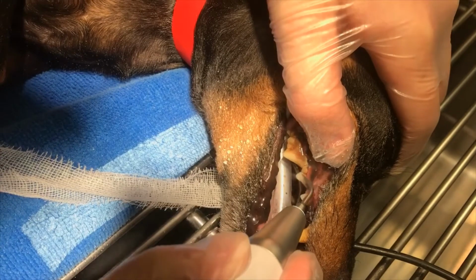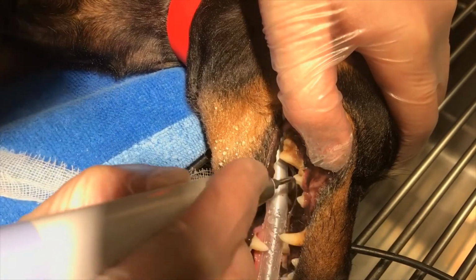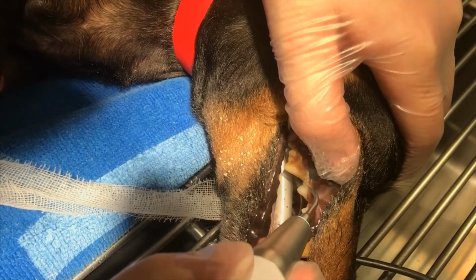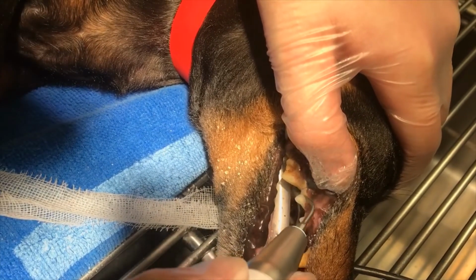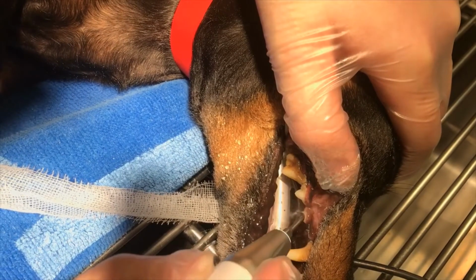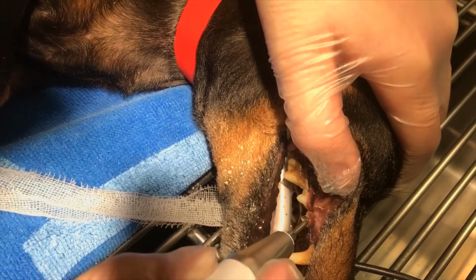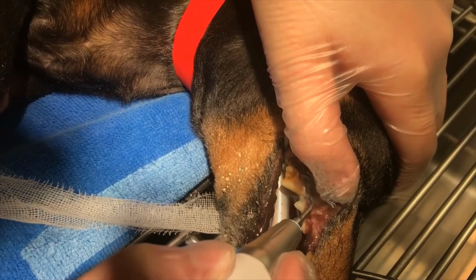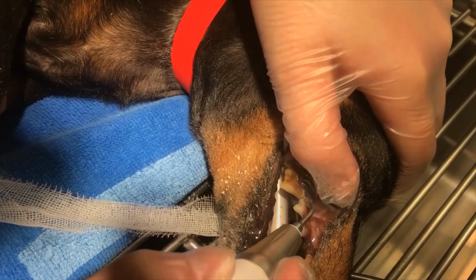It's better and easier to use the wider part of the ultrasonic scaler, as you're going to get more contact space. Your footprint will be larger, allowing you to break off those pieces and chunks easier. I'm going to move all around the tooth on all sides. And now once I'm done on that tooth, I'll move back to my other tooth I was working on. There again, that 10-second contact time.